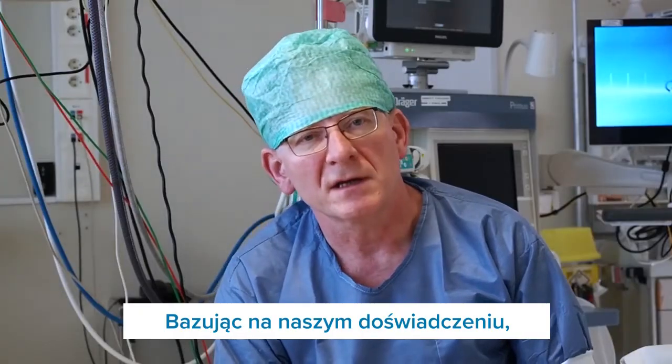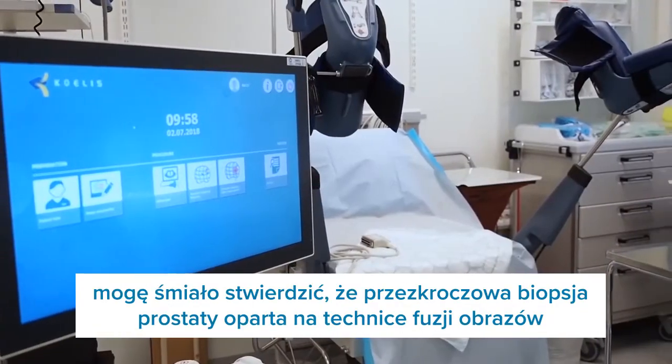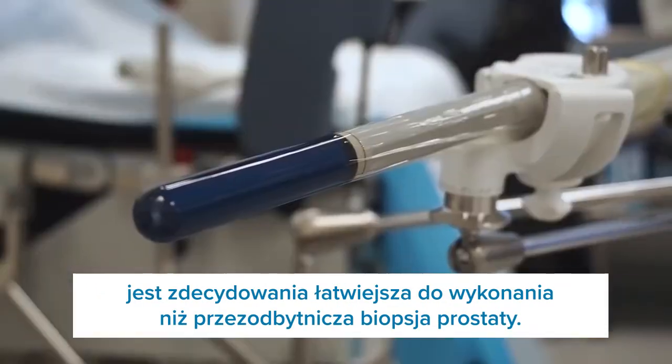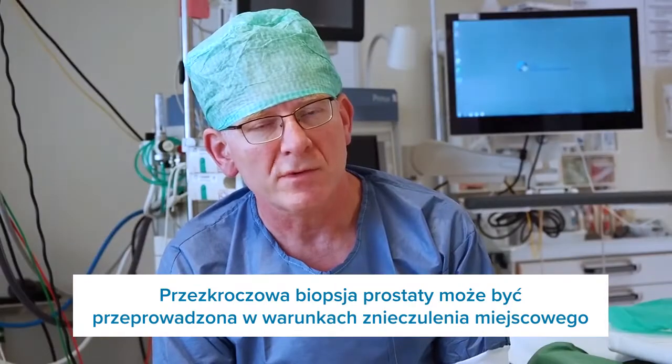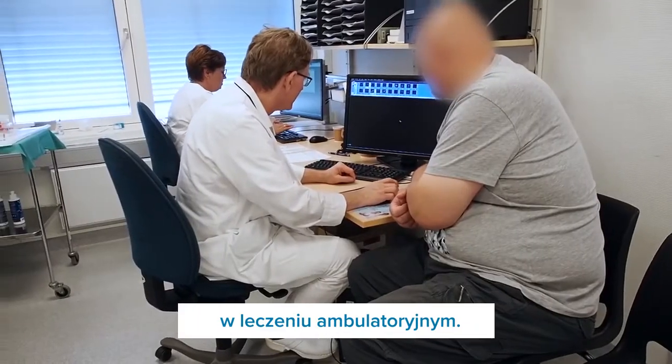From our experience, I can say that transperineal prostate biopsy based on image fusion technique is easier to perform than transrectal prostate biopsy. The transperineal approach can be used under local anesthesia in an outpatient situation.